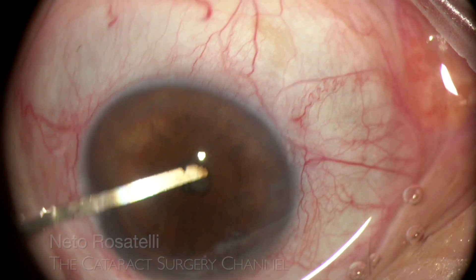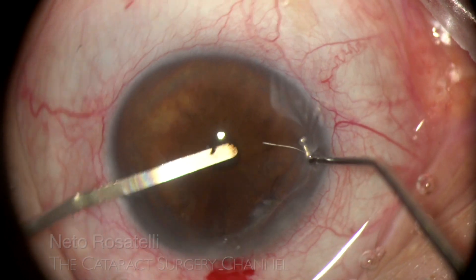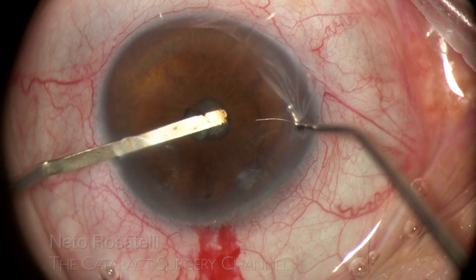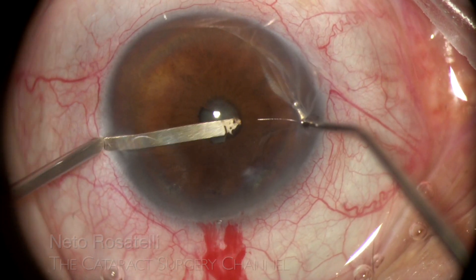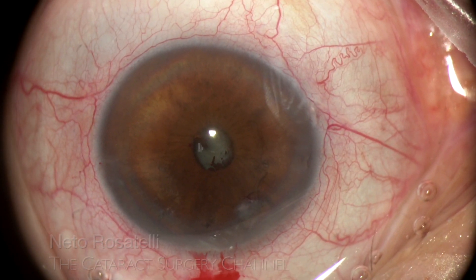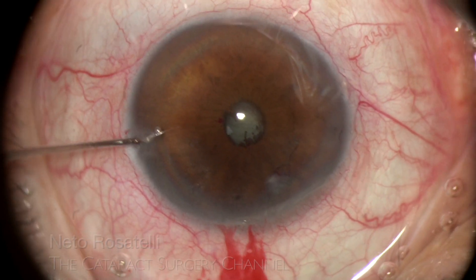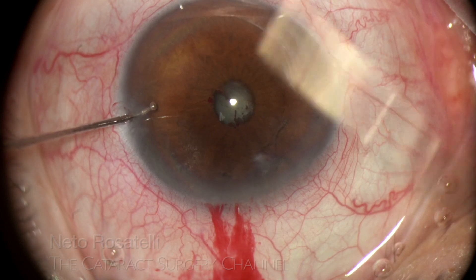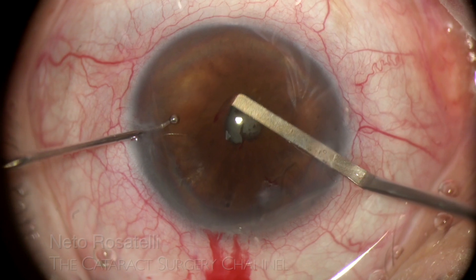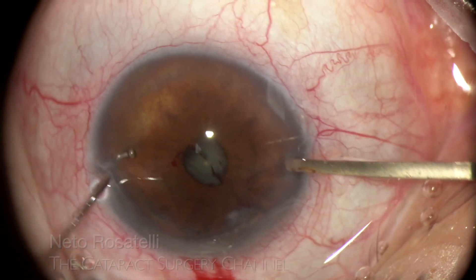The spatula is then swept under the iris to break any posterior synecchia, and we can see that there is none. Going from the other side in an analogous fashion, we can see that the main issue here are inflammatory pupillary membrane fibrotic remnants, which are better managed with a forceps.